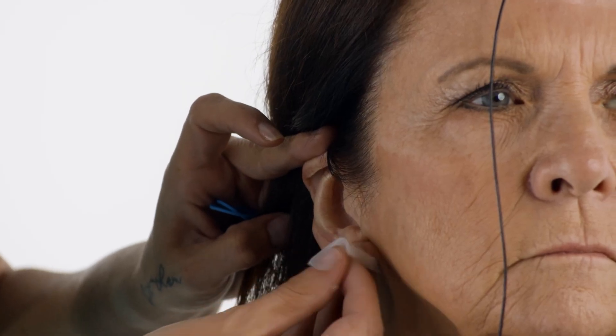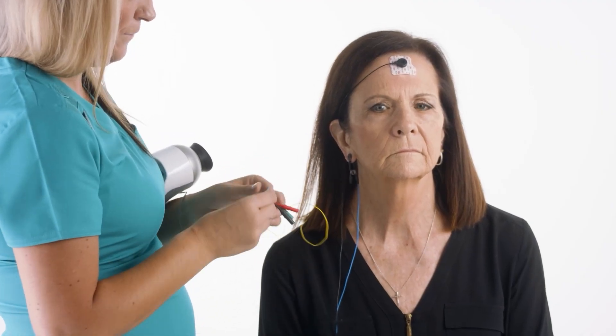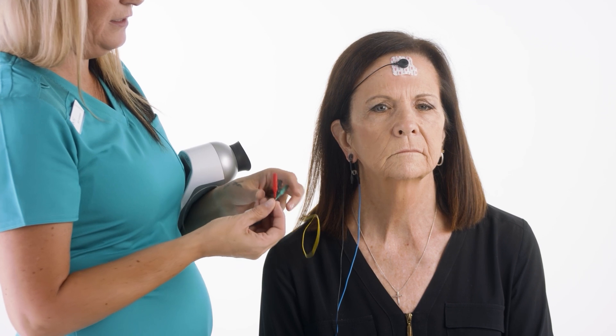Next, wipe the patient's ear and attach the ear clip or the ground electrode to the ear. It doesn't matter which ear. After you've placed these three electrodes, you'll want to make sure that each connection is attached to the proper cable.